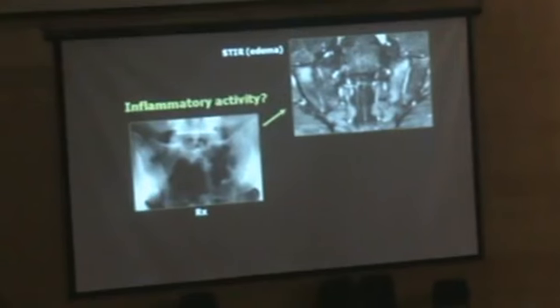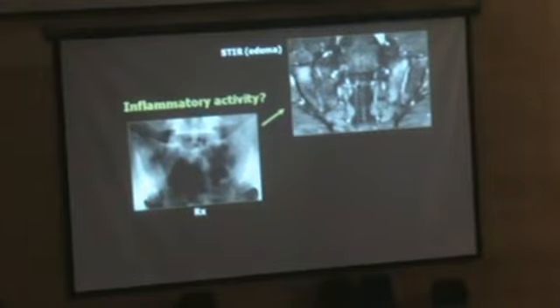But MRI is better because we have a nice anatomic overview of the joint, which scintigraphy usually doesn't give to us. So STIR sequences are highly prescribed by rheumatologists, and this is even in the criteria I showed you. They only put STIR, they don't put T2 fat suppressed sequences or proton density fat suppressed sequences. I personally think it's the same, but we need studies to show that.